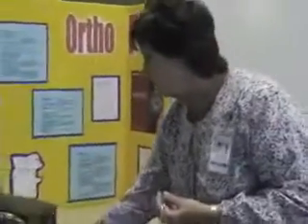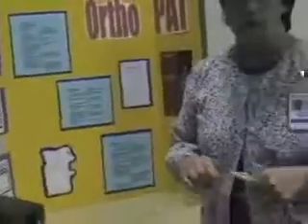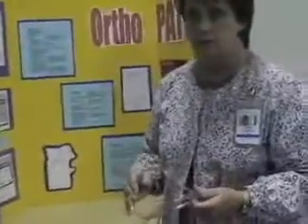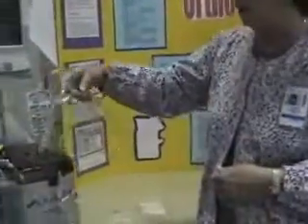All right. And documentation is done in Epic. We have to add a category for lines and drains, OrthoPat, and we put how much comes out, and then our reinfusion is under blood and blood products, and product type is OrthoPat reinfusion. We put the time and amount that we give back in there. So for those hospitals that are on the computer paperless system already, they would have to put in their own column for the OrthoPat. It's not a standard column. Right. Correct. And if you're doing paper charting, you would just chart it under your intake and output.